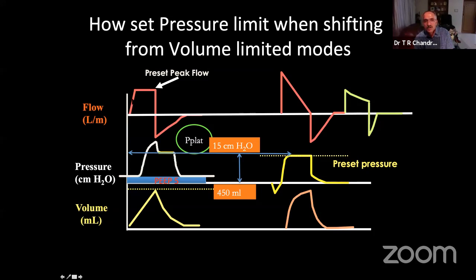And I have told you, it's a fixed flow. It's not very comfortable to the patient. So this mode should be used only when the patient is passive, not meaning that he should be paralyzed. A lot of patients can be kept passive by good sedation. And there are many conditions like GB syndrome, OP poisoning, where the patient is passive by himself, isn't it? So there are indications in a sick ARDS. Volume controlled ventilation is what we generally do.